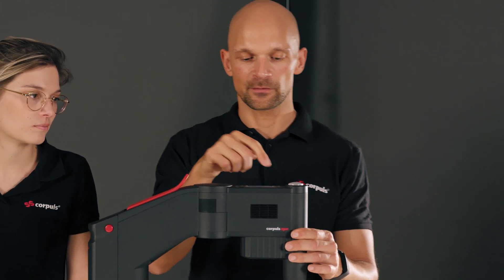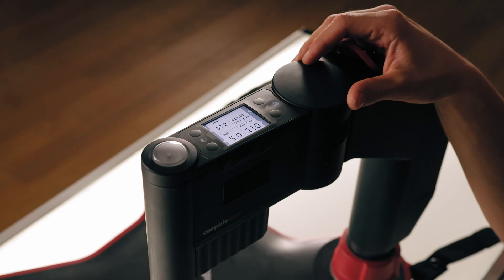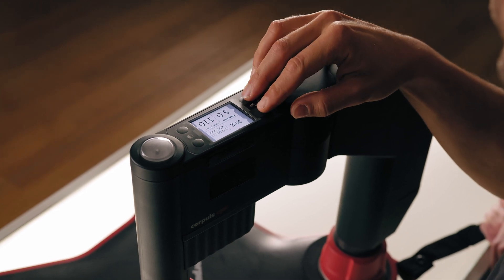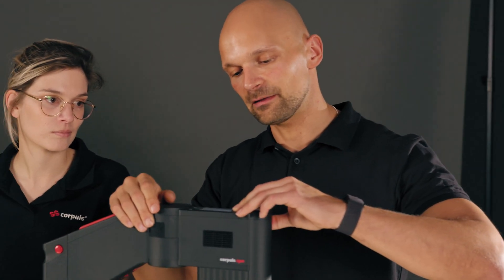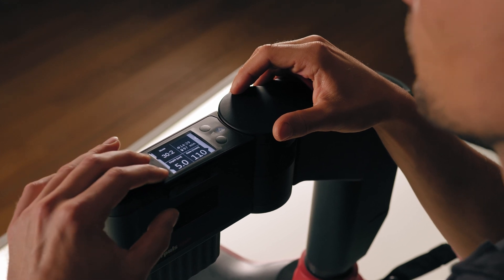Various soft keys are arranged next to the display. By simultaneously pressing two soft keys on one side, you can change the screen direction, which improves readability on the other side. If I press the buttons on the left side at the same time, the display inverts, and I can read it better under adverse lighting conditions.